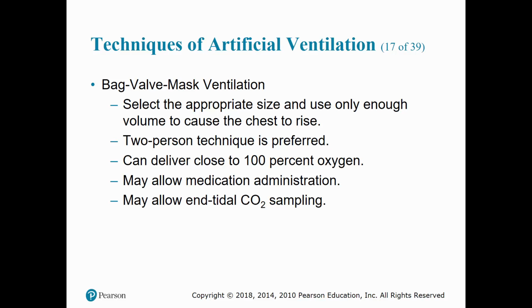Some other advantages of it is it does allow us to monitor their CO2, as well as administer medications when appropriate. When using this, make sure that you are using the correct size bag, whether it is for an adult, child, or infant, where it's administering enough volume to cause the chest to rise.